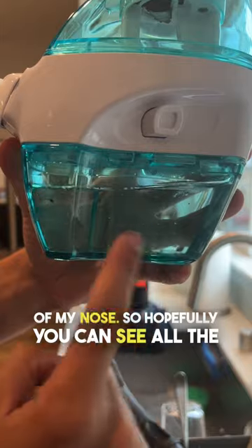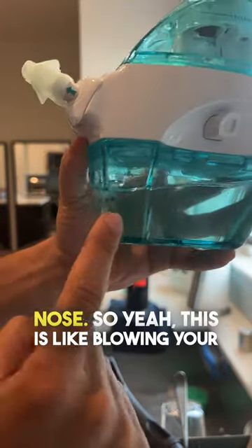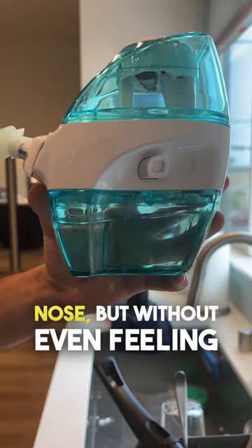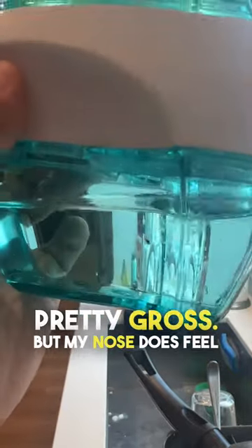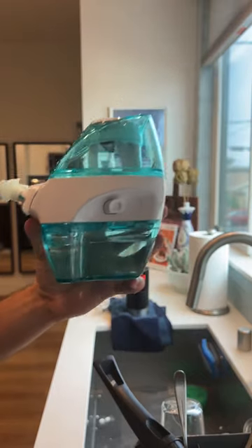Hopefully you can see all the little particles floating. There's even some blood there because I have a pretty dry nose. This is like blowing your nose, but without even feeling any pain because it just sucks everything right out of your nose. It's pretty gross, but my nose does feel better now, and we'll see if I breathe better after a few weeks of doing this. I'm leaking.